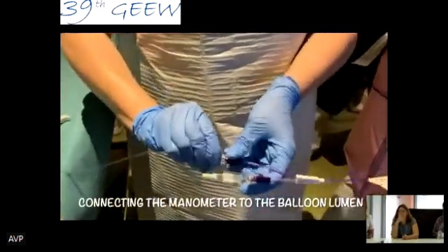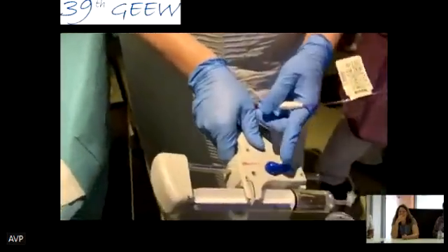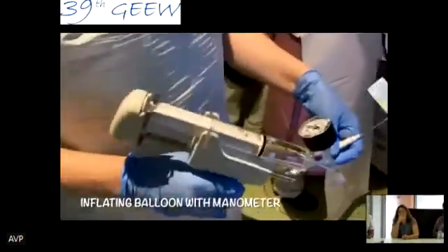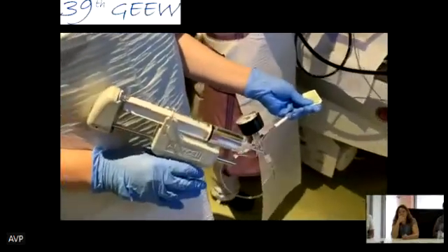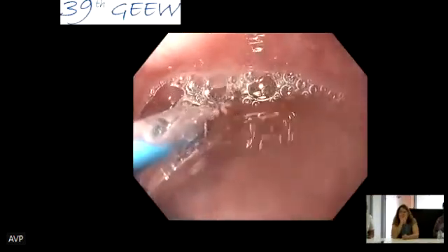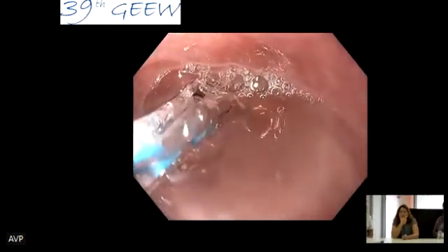Then we connect the manometer to the balloon lumen and we will inflate. So we're in the direction of inflation. You always have your instructions nearby, and you follow the inflation.